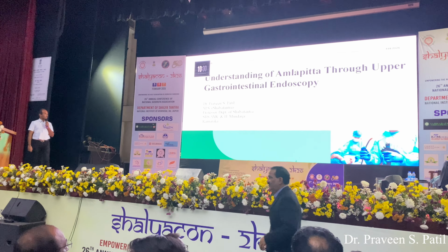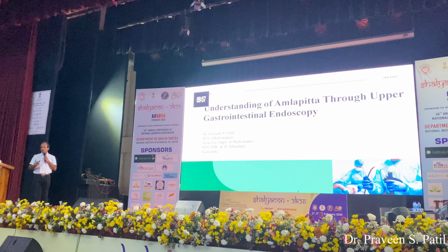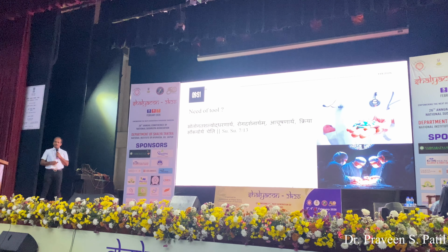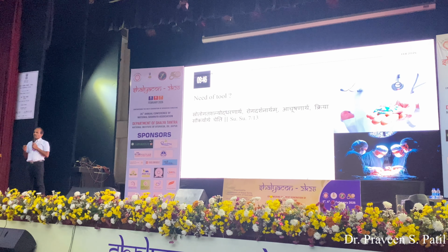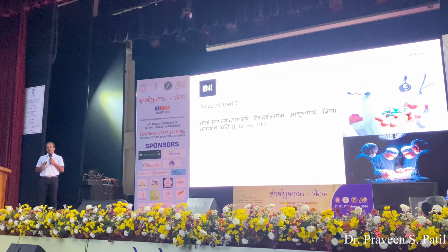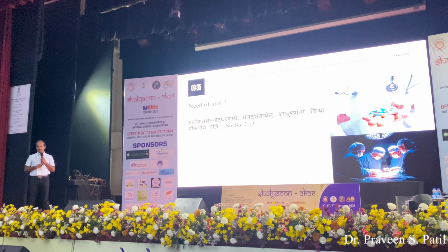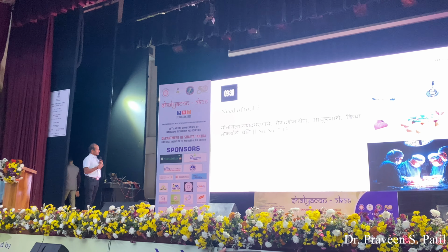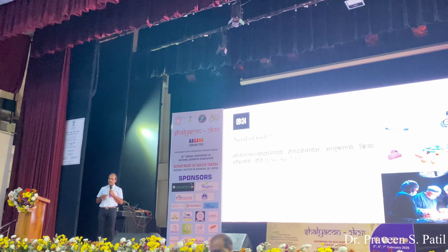The given topic for me is understanding of Amlapitta with the help of upper GI endoscopy. See, Amlapitta is treatable by medicine as well as surgical interventions. The instrument which gives us a clear-cut line of demarcation to decide whether this is a surgical case or a medicine case is the upper GI endoscopy, that is the Nadiyantra, which helps us to do the Shrotogata Shalyodharanartha, Roga Darshanartha, Achosanartha and Kriya Saukaryartha.